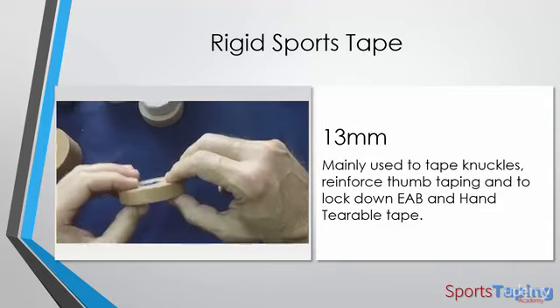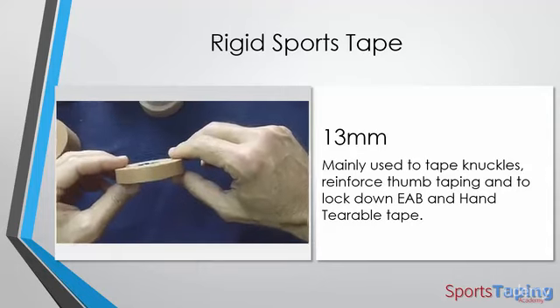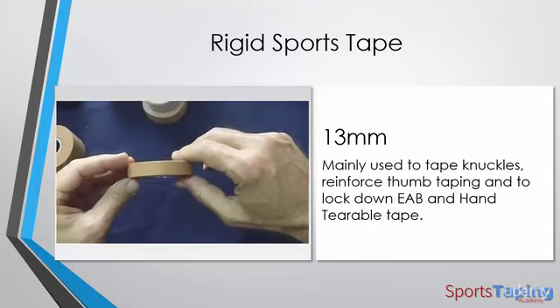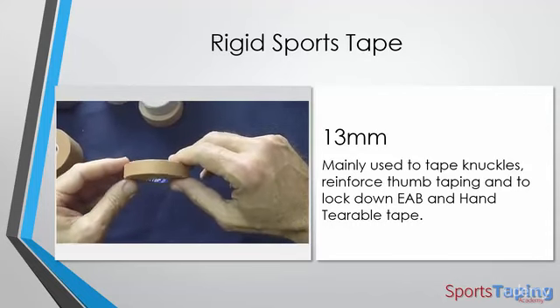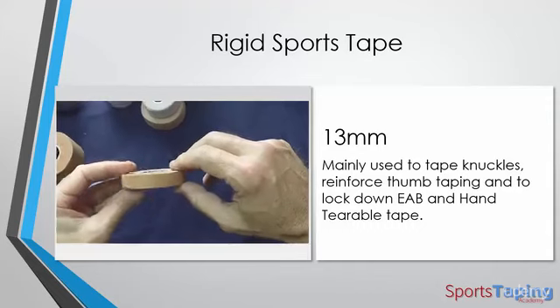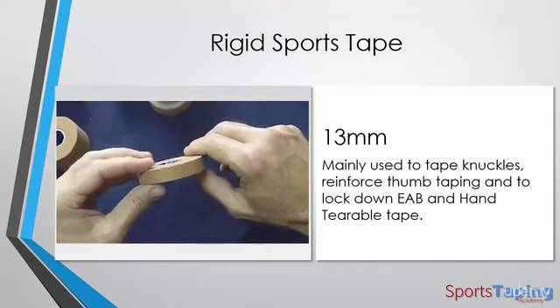The 13mm tape, very, very narrow tape as you can see. And this is usually used just for those small joints like knuckles. It can also be used to reinforce other taping, like say to reinforce the taping of a thumb and also to lock other taping down.